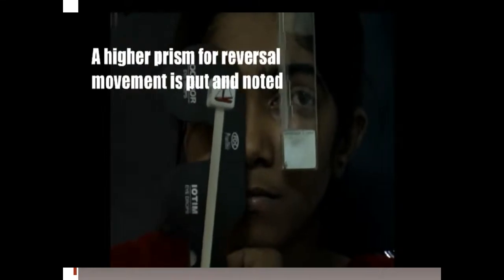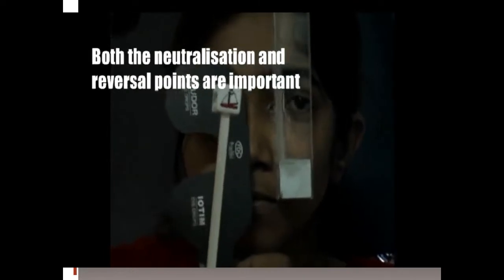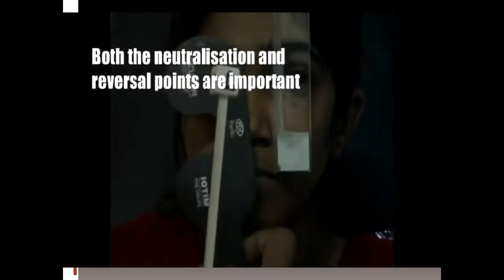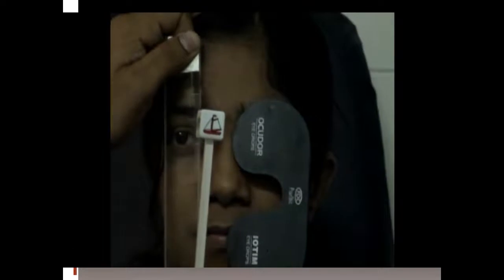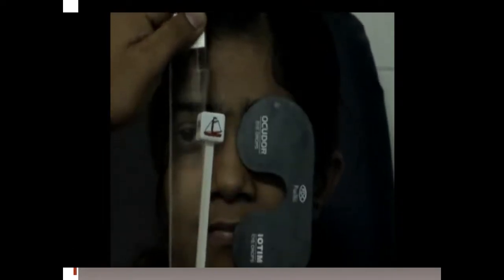You always go back to the other eye. You measure fixing right eye — right now you are measuring fixing right eye. We had already measured fixing left eye. If the prism is in front of the left eye, the measurement you are getting is fixing right eye; if the prism is in front of the right eye, then you are measuring fixing left eye. A lot of times teachers ask: how do you know whether it is fixing right eye or fixing left eye? Wherever the prism is, the other eye is the fixing eye, and that eye is the center defining the deviation of the other eye.